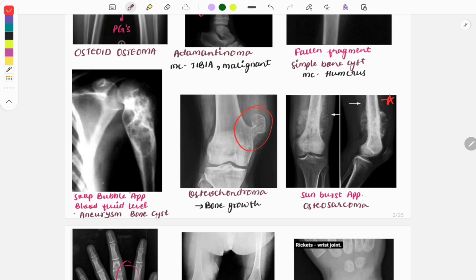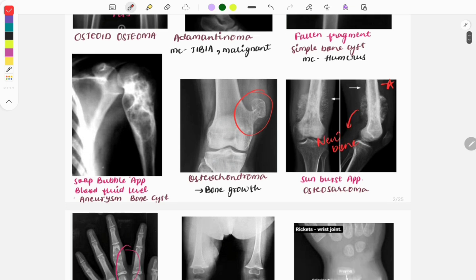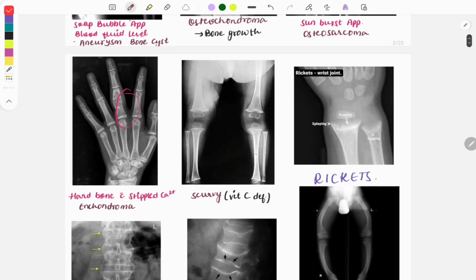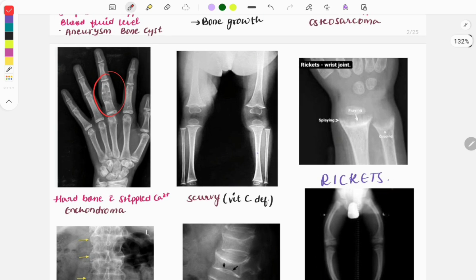Questions are asked about the reason for the sunburst appearance — it is due to the formation of new bone, and this reaction is called the sunburst reaction. The enchondroma mostly involves the hand and shows stippled calcification. The next X-ray is of a child suffering from scurvy due to vitamin C deficiency; on the X-ray you can see classical findings including the Wimberger sign.